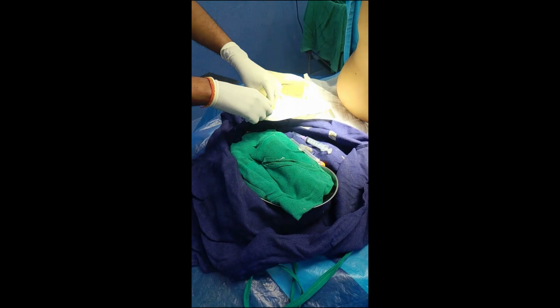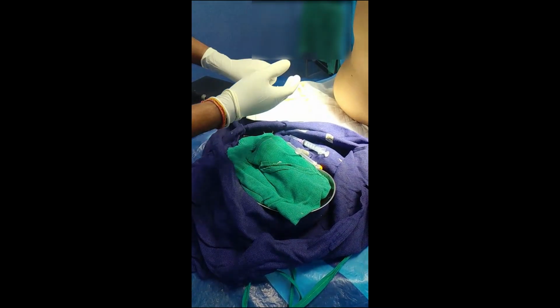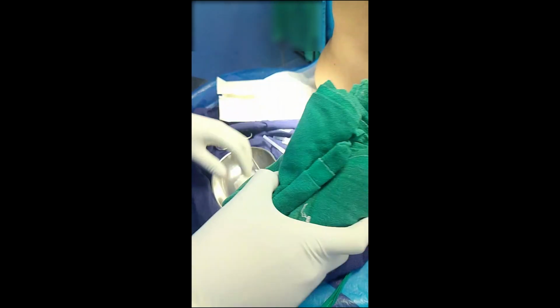I have already opened the spinal sheet and now I am wearing the gloves. Make sure it's sterile. Don't touch anywhere in an unsterile area.